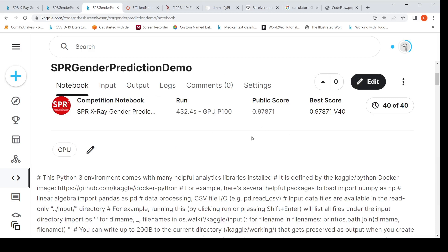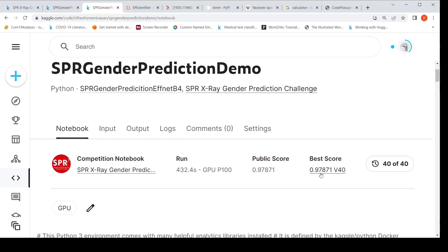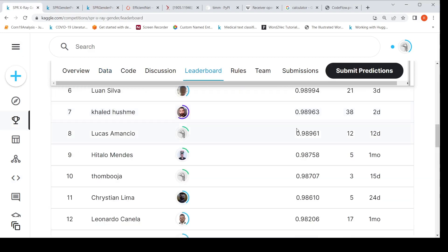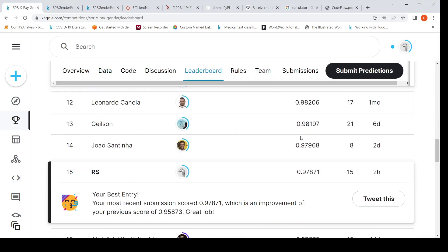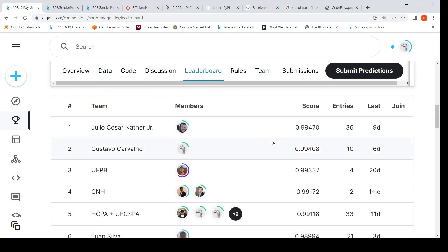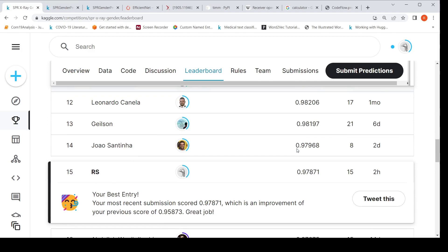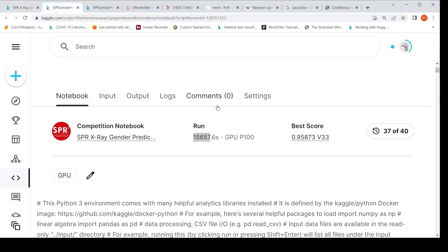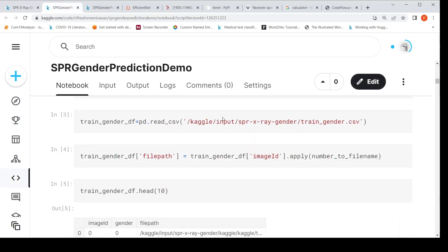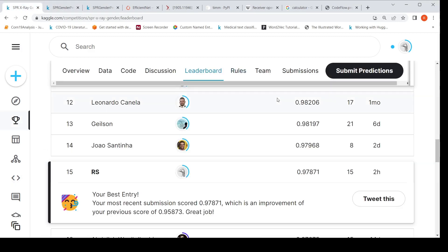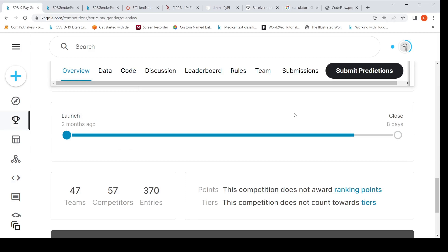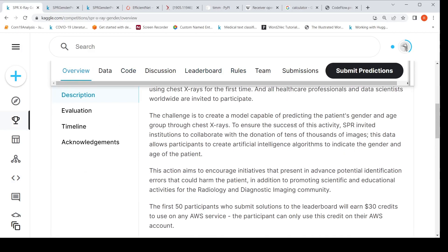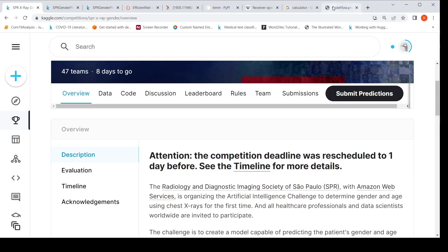When I submit the submission.csv file, I get a score of 0.97 area under curve. My current position on the leaderboard is around 15th. There have been other submissions scoring higher — somebody has even achieved an area under curve of 0.99. You can look at this notebook and further fine-tune the hyperparameters to improve the results. The overall idea is that you can use EfficientNet as a deep learning model to take a chest x-ray image as input and predict the patient's gender.